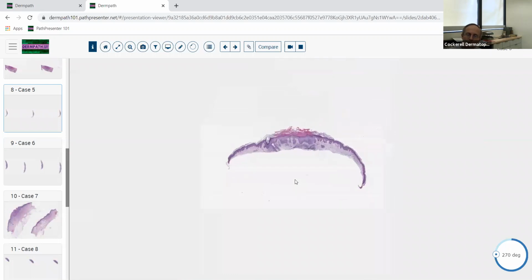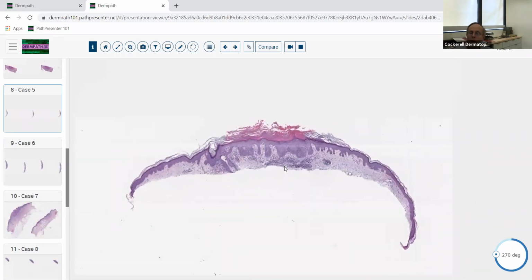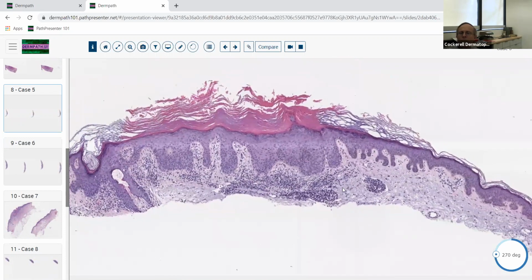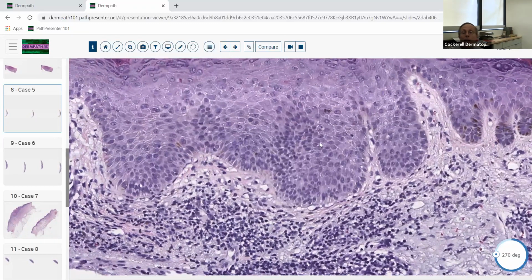Now let's move into the so-called precursor lesions of squamous cell carcinoma, solar keratoses. Some people call them precancers. They're really not precancers. They're actually little mini cancers, and they're just kind of kept in check. If you actually look at the genetic profile, if you will, of an actinic keratosis like this, it's really got the same genes as a fully developed squamous cell carcinoma.